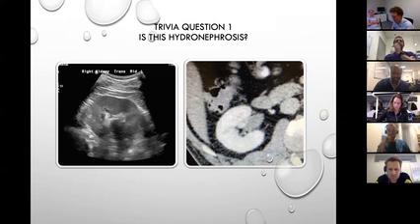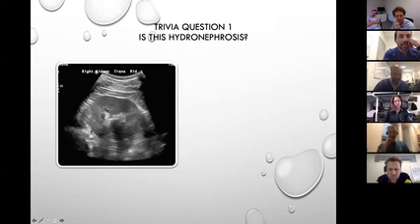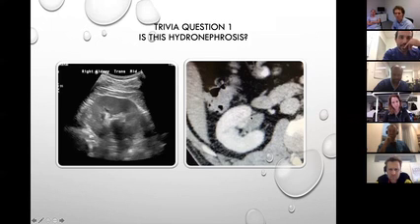All right. So if we go back there, it almost looks like it's coming from inside, but the kidney wraps around like that. The pelvis looks like it's inside the kidney in a longitudinal view. But if you go on a transverse, you can see that it's actually outside the kidney, like in your CT scan. What's the clinical significance of that, Vijay?